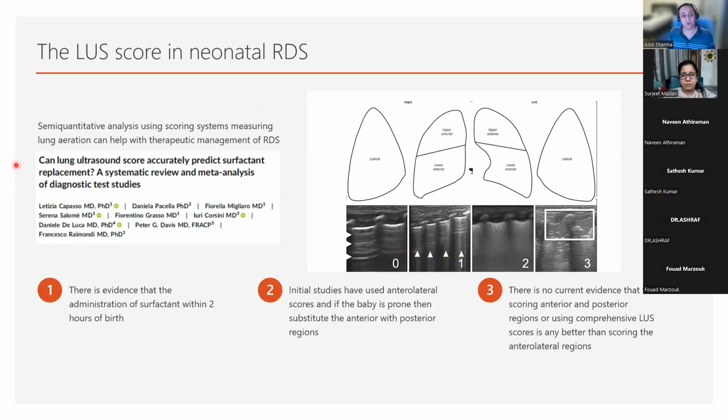It sounds very unanimous amongst all of you. I'm just keen, does anybody have the opposite view? Yes, please. Just introduce yourselves one by one. Hey guys, I'm Anne. I'm in Dublin, and I guess the only caveat is I think people have to be trained in lung ultrasound. So the joy of a number simplifies things for maybe people that don't have good training in lung ultrasound.